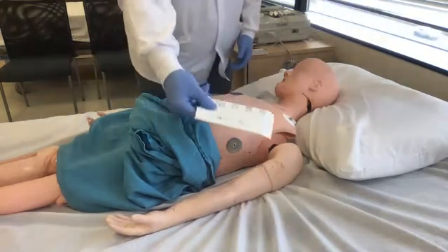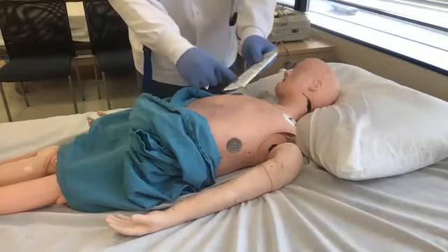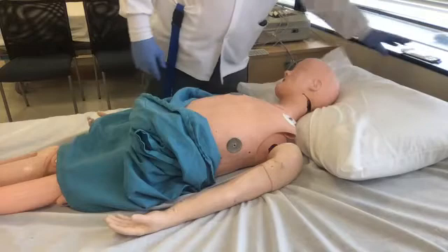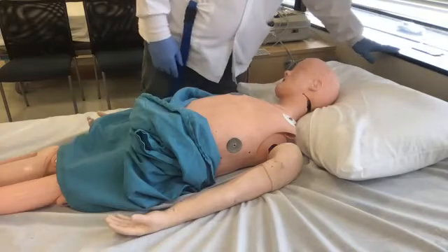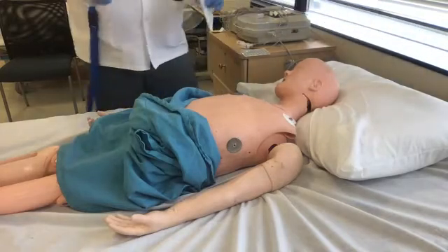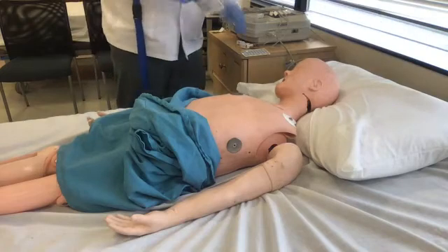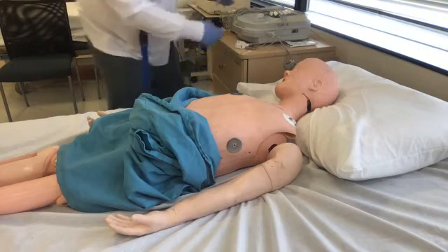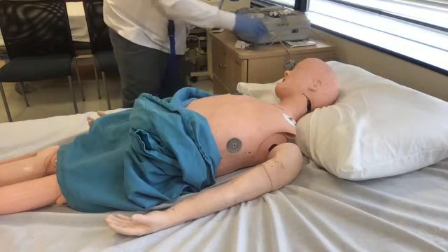Another thing about these electrodes, you'll see all these warnings on it. Keep it dry. Don't leave it here. How many times have I had students leave it here? They're light sensitive. So after you use one set, you put it back, okay? Now, you'll also notice here how the machine is all nice and neat.